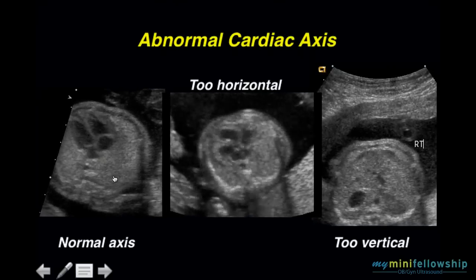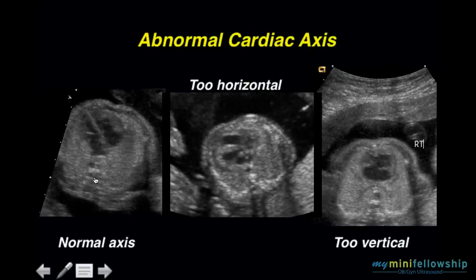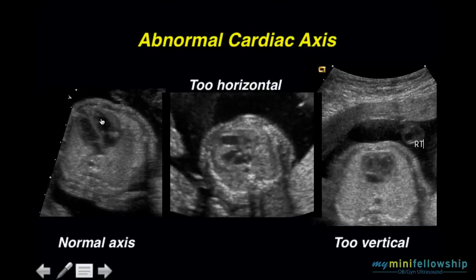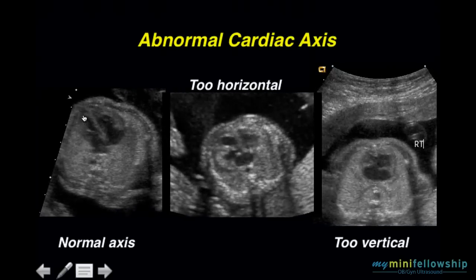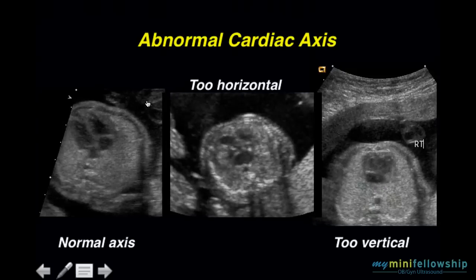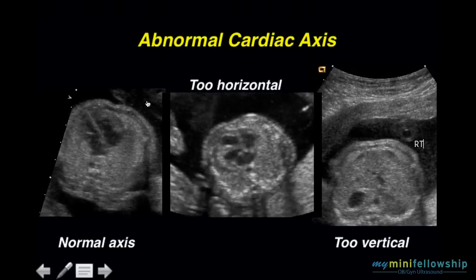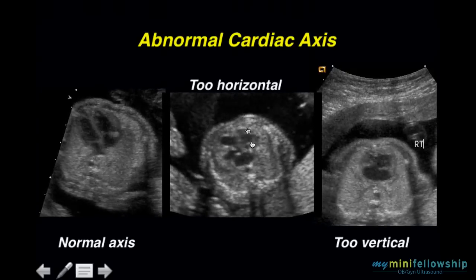So here again, just visually drawing our midsagittal line and our interventricular septum line, we can see that the axis of the heart is normal.